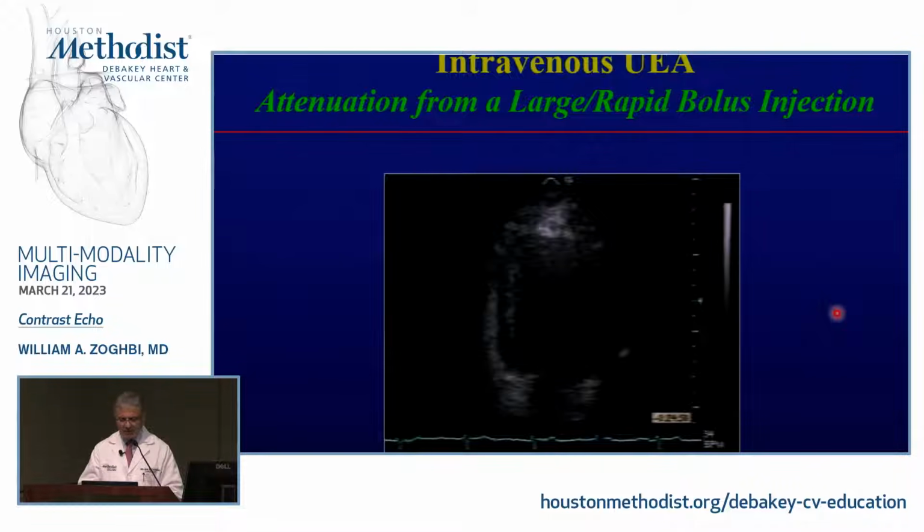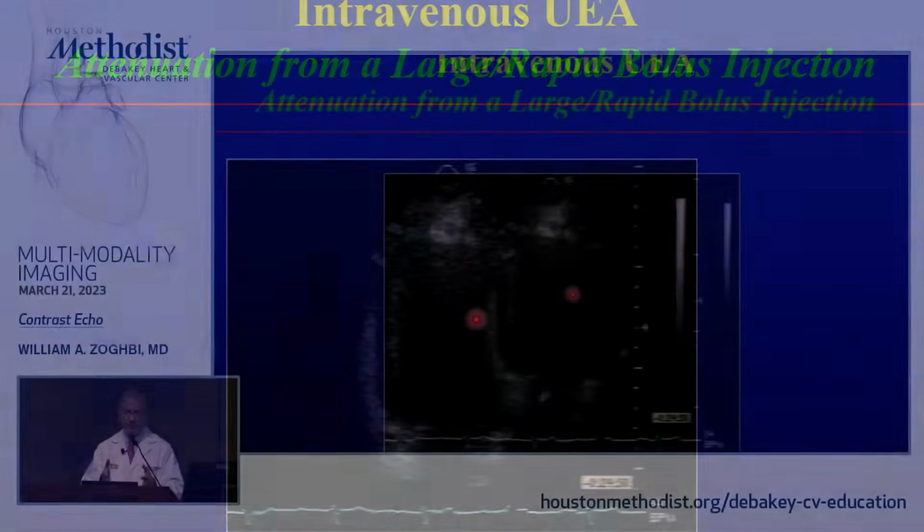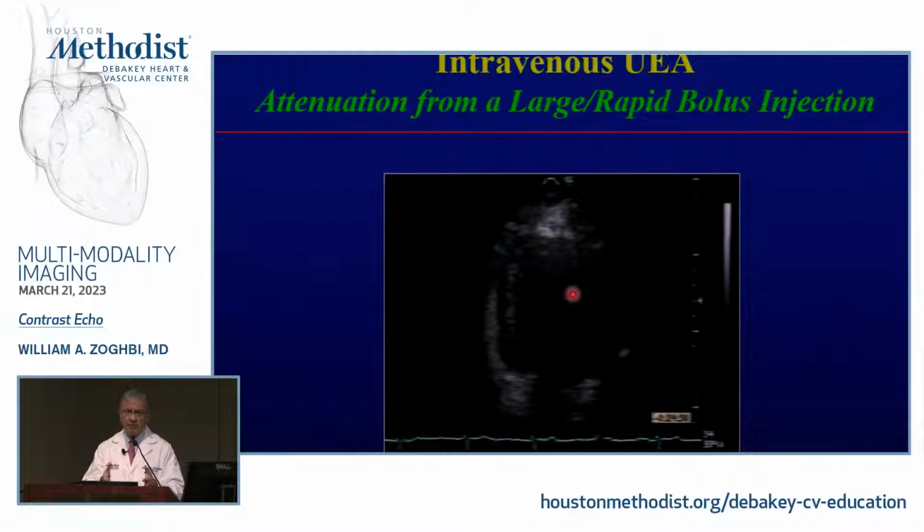So now notice also, and that's what you're going to see, the ultrasound beam is coming this way. These are the scans, right? The right side is here, and the left side here. You're not seeing much because for you to see contrast, you have to decrease your mechanical index, which is the energy that is sent to the heart for it to be reflected. So I barely can see the heart, and I'm concentrating mostly on seeing what happens with contrast within this cavity. So let's play this.